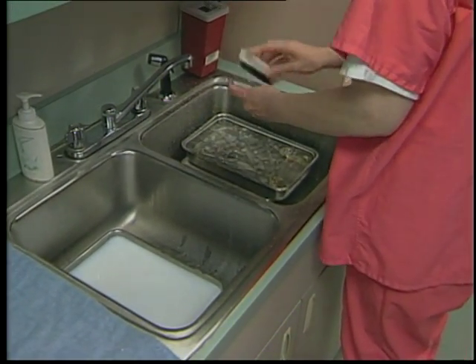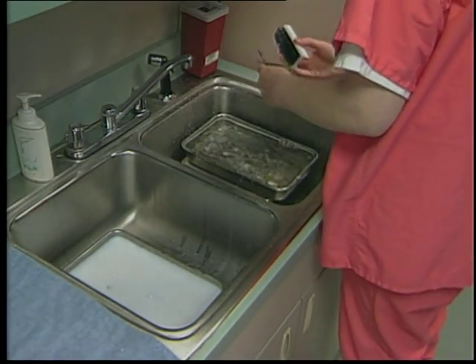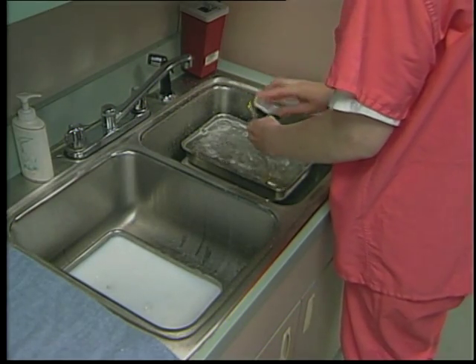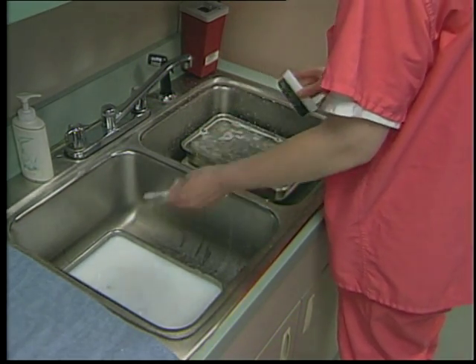Next, the instruments are often allowed to soak in a solution called instrument milk for approximately 10 minutes. This non-oily lubricant provides the instruments with a protective barrier that helps retard corrosion. They are then allowed to air dry. If instrument milk is not used, they should be hand-dried.